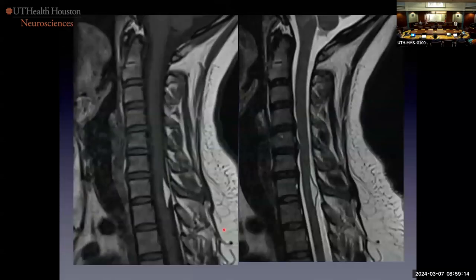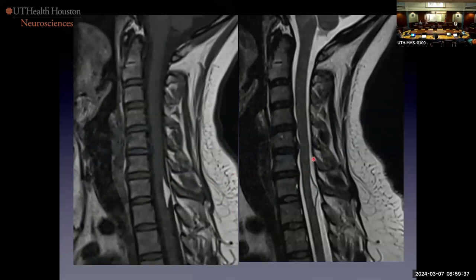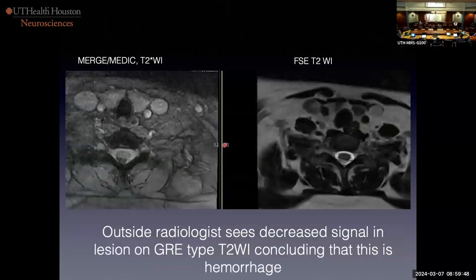One more case. This is a case from Jessica that had been called a cord hemorrhage. It's bright on T1 and bright on T2 — you might think it could be extracellular methemoglobin, late subacute. The patient had symptoms of body numbness a few days before, no symptoms before that, and then got completely better. The outside radiologist looked at the T2s and GREs; seeing things get blacker, he concluded hemorrhage. But there was no fat sat done. The first thing I do is look for my tools — the sagittal T2 with chemical fat sat. You can tell it's chemical fat sat because it's losing saturation posteriorly. On the T2, it's bright; with fat sat it got darker. There's really no other explanation than that it's fat.